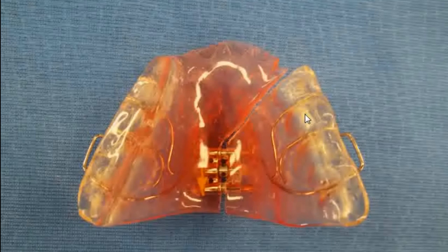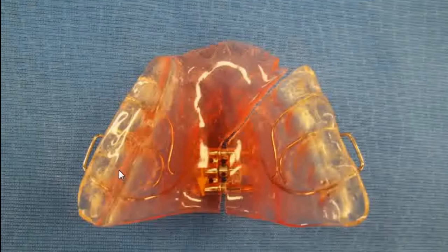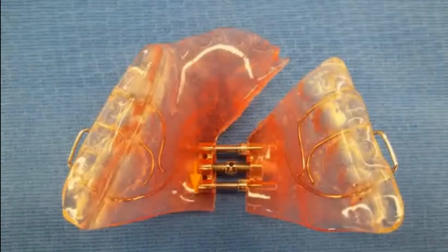Acrylic onlays are added to disclude the posterior teeth to allow the crossbite to be corrected without interference. The acrylic on the side that is in crossbite is smooth so it can slide over the occlusion. The side in good occlusion will have deep indentations with the lower arch to provide additional anchorage. We can also add a flange to engage the lower posteriors to increase the anchorage as well.